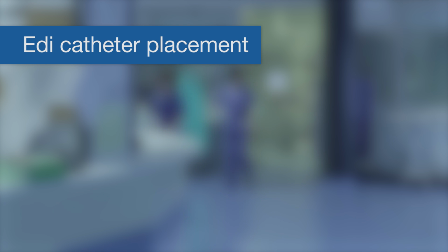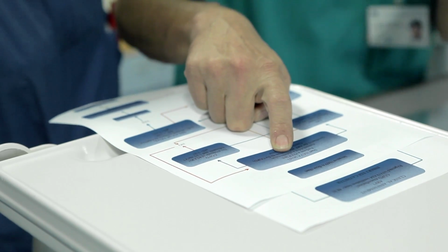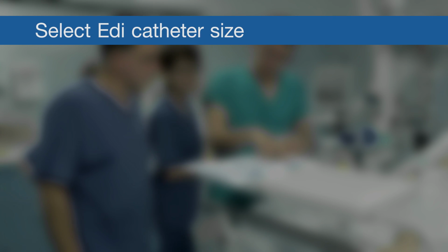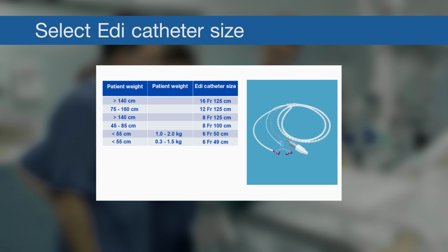Dr. Muttini and his team will now demonstrate the application of EDI on an ICU patient. They follow a simple standard procedure for insertion of the EDI catheter. Select EDI catheter size for the patient. You need to know the patient's height. A table provides more details.